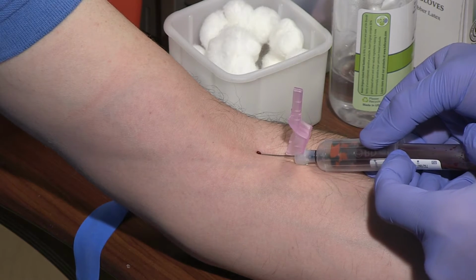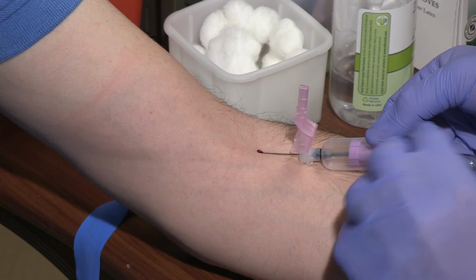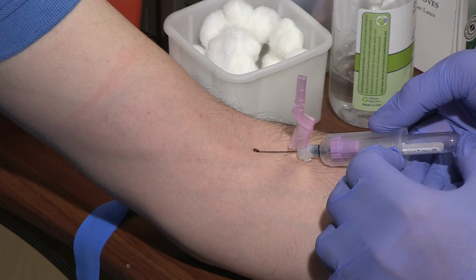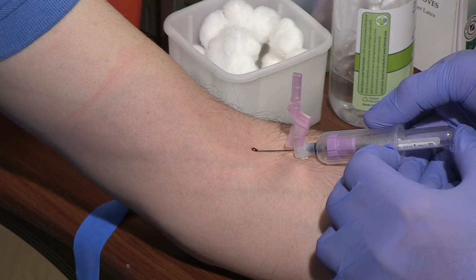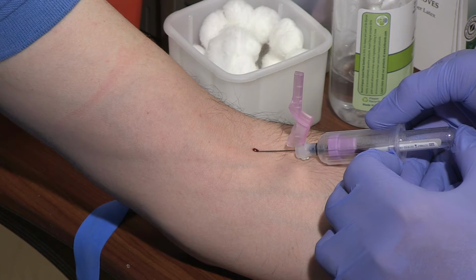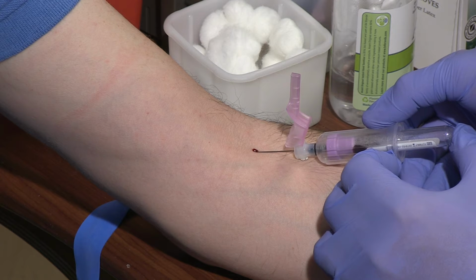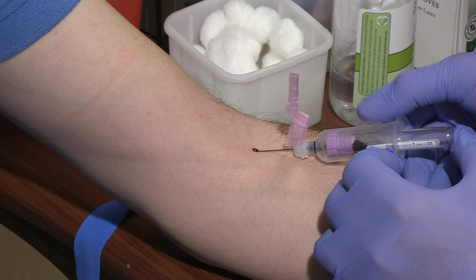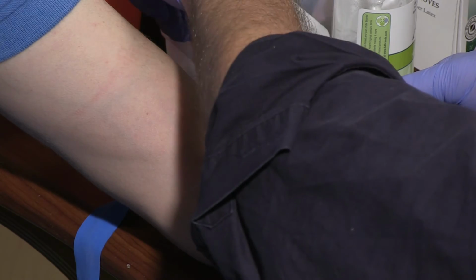and must be discarded. The lab order from the provider for this procedure will require 2 tubes be collected. The medical assistant must demonstrate that he or she knows the correct order in which to collect various types of samples. The medical assistant must release the tourniquet before the first sample tube is filled and definitely before the needle is removed from the vein. The sooner the tourniquet is released, the less bleeding and bruising there will be upon removal of the needle, and the more accurate the venous blood sample will be for the lab studies.